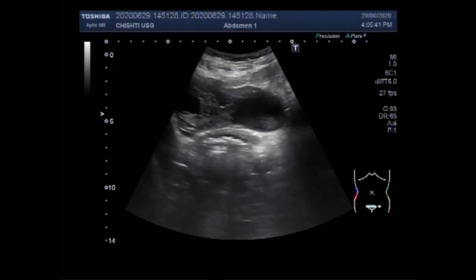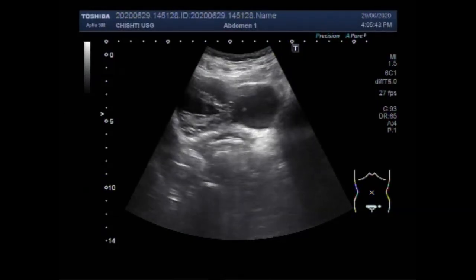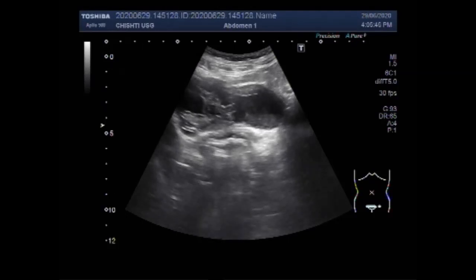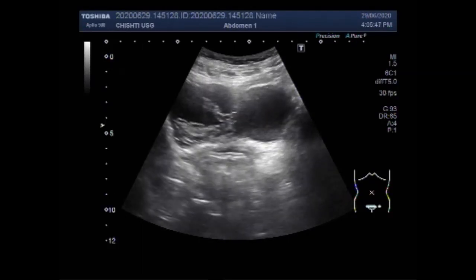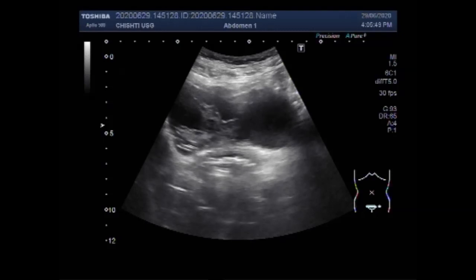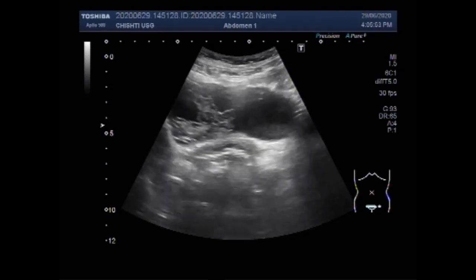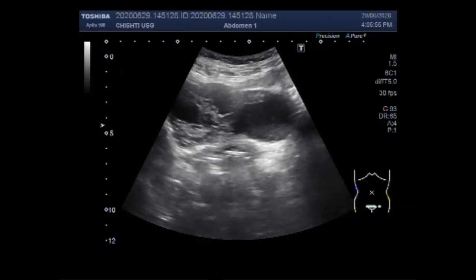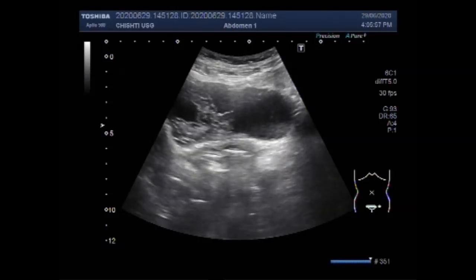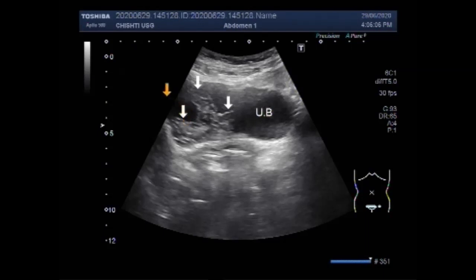Dear viewers, I hope you are all fine. This video shows a case of basical growth — a mass in the urinary bladder. You can see the urinary bladder and a mass is seen in the base of the bladder, attached to the left lateral wall of the urinary bladder.